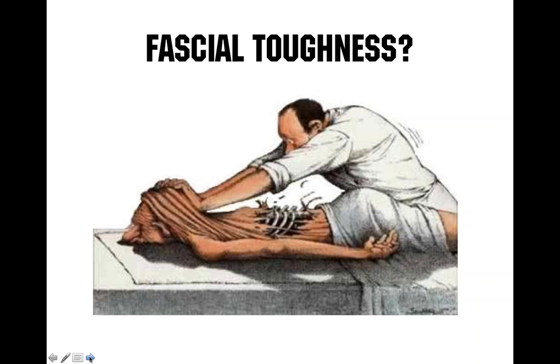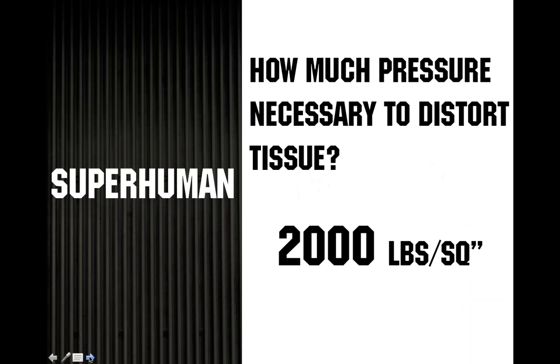Maybe not our geriatric patients, and definitely not our pediatric patients, but some people just crave this, that type A behavior. They have to have it in order to make a change. And again, it's up to us to educate that athlete or that patient on whether these changes are occurring the way we think they are. Are we really making these mechanical changes? And again, if that's what they want out of it, then that's great. But we know, at least through this course, the research is suggesting a little bit more neurosensory.